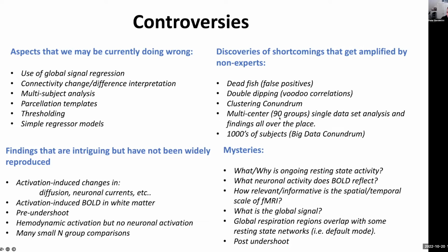It sort of shows, right now in this course, you're learning analysis pipelines. And you'll go back to your group and you'll analyze data and you'll produce results. But the fact is that different centers have very similar pipelines that might vary a little bit, maybe in pre-processing or how they choose the thresholds or the regressors. And it will come up with results that can be amplified as different depending on how they choose their thresholds. So this is an important point. I think that there should be a reanalysis of this, a meta-analysis of this data to show how it might be very similar if you just tweak a few things in terms of the final results.